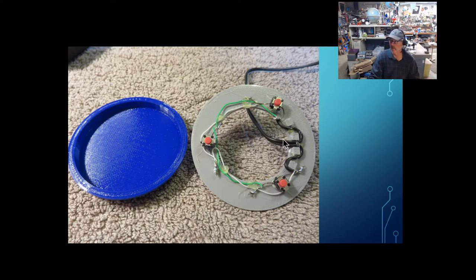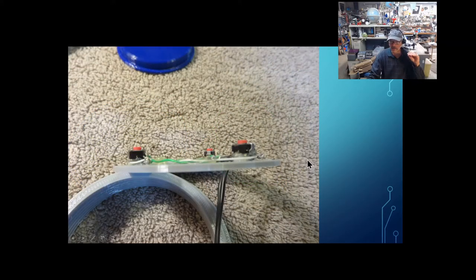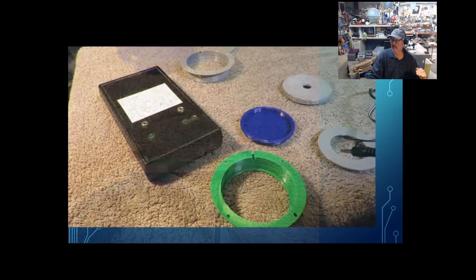That's not a problem. But use a minimum amount of hot glue, and you also want to keep things down low. You don't want big gobs of hot glue, because when this button, the blue plastic here, pushes down, it just rests right on top of these red switches, you see. When it gets pushed, it just activates those switches. So you want to make sure there's nothing to prevent it from being activated.